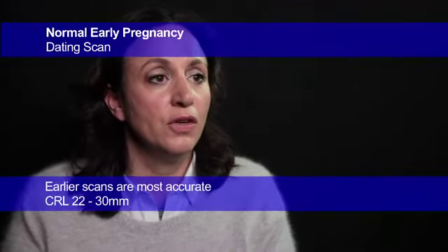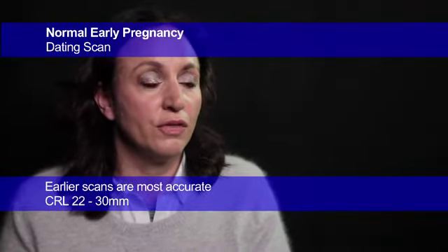Having described the normal features of early pregnancy, let's now go on to another very important purpose of early pregnancy scanning, which is dating. Dating the pregnancy is one of the most important factors in antenatal care, and the accuracy of dating, both in taking a history and on scanning, is very important to perfect. As you know, clinically we date a scan from the first day of the last menstrual period. So earlier scans are most accurate for dating.